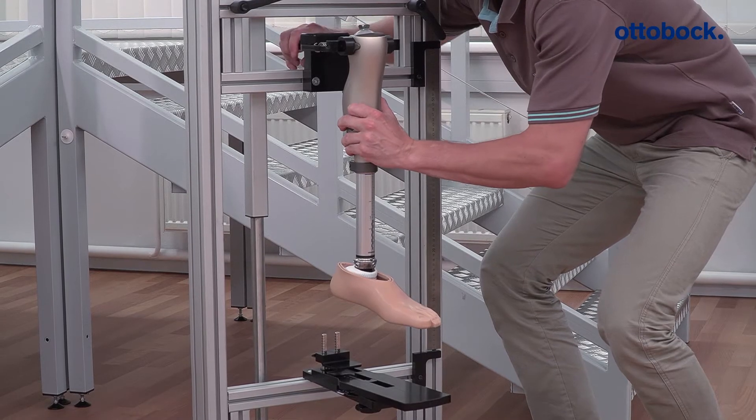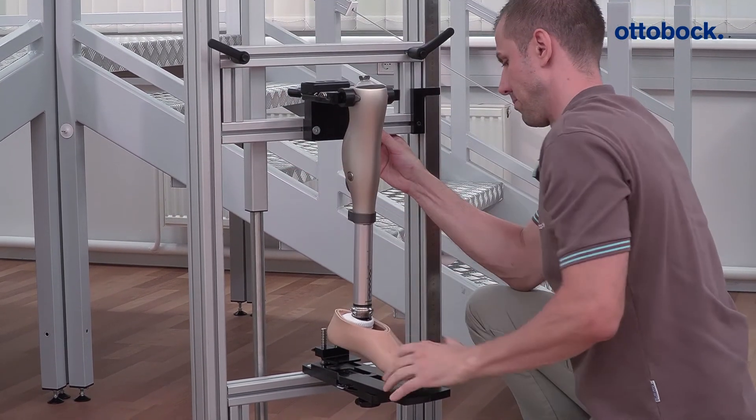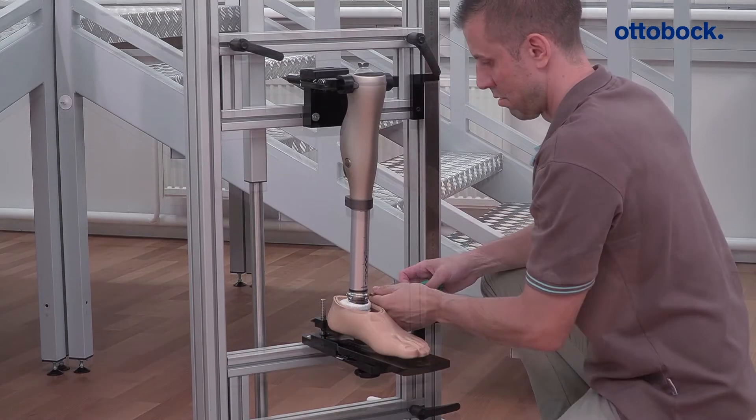Clamp the knee joint in the alignment tool using the adapter inserts specified by Ottobock and adjust the length according to the user's data.